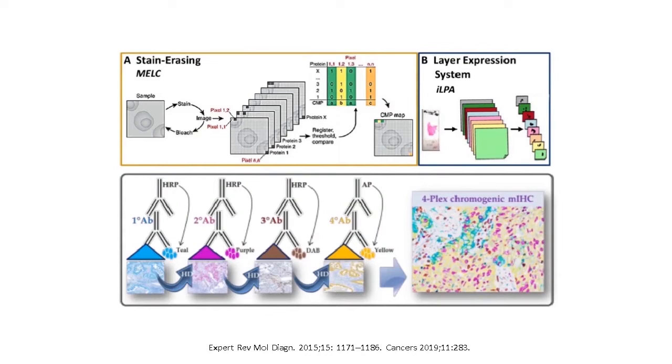These are then conjugated with metal isotopes in both cases. And by using the CyTOF technology, you can then image those in one slide with sometimes slightly less in the way of resolution than the classical immunofluorescence techniques.